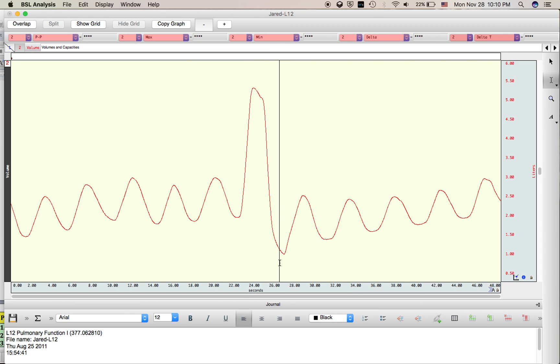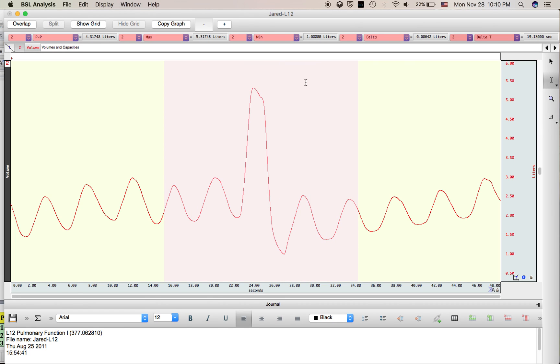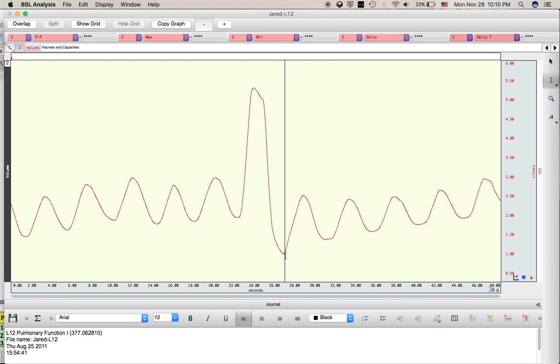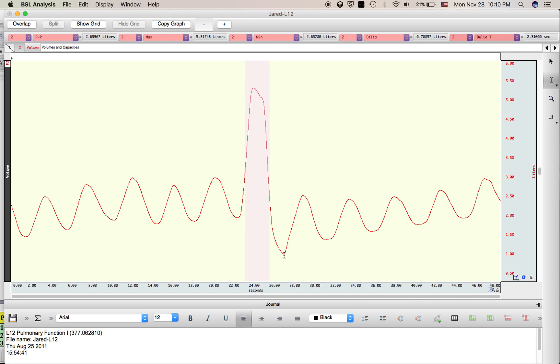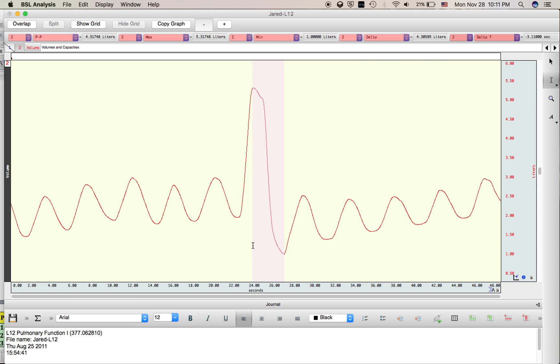To determine the residual volume, we're going to use the minimum tool, and it is set at 1 liter. Notice that if I highlight any more to the left or the right, the minimum value doesn't change because this is the lowest value on the figure. Similarly, I'll look at the max value for the maximum inhale, and this gives me the total lung capacity — the maximum value is 5.32 liters. So 5.32 minus the 1 liter residual volume gives the same peak-to-peak value of 4.32 for vital capacity. Adding the residual volume to the vital capacity gives 5.32, which is the total lung capacity.